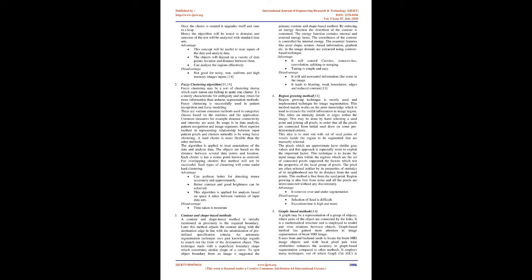4. Anisotropic diffusion filter. High-frequency noise is present in magnetic resonance images and needs to be removed by a filtering process. The anisotropic diffusion filter, ADF, is proposed in various filtering applications to adaptively remove the noise, maintaining the image edges. However, when used for the first time, ADF methods still produce unsatisfactory results. While previous ADF implementations used the gradient of the strongest edges or the standard deviation of a planar region, i.e. without any edges, for filtering, a novel approach is proposed with improved parameter estimation based on both edge and planar region, overcoming some of ADF's important limitations.